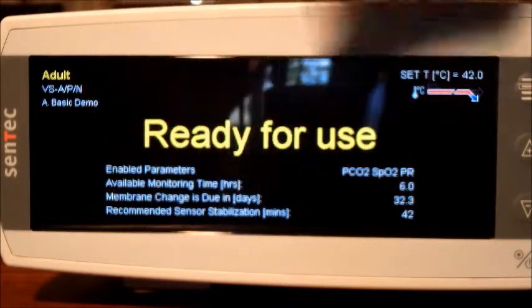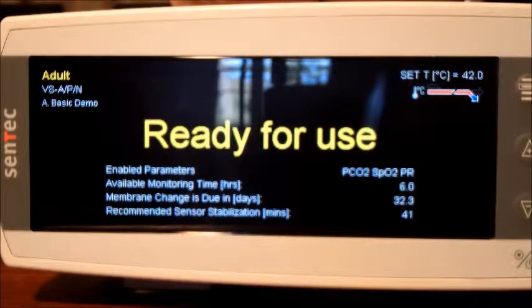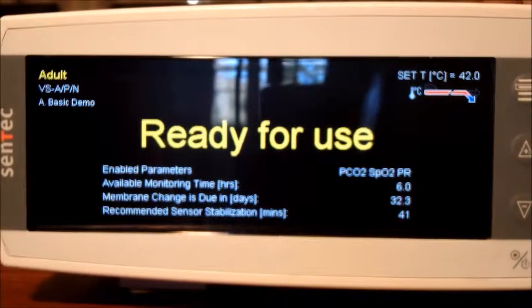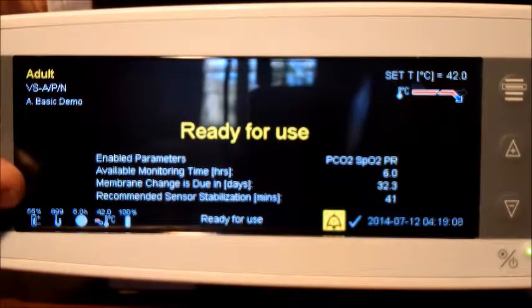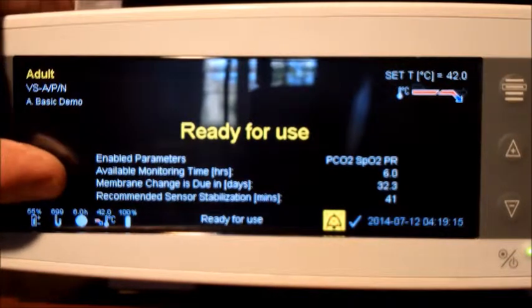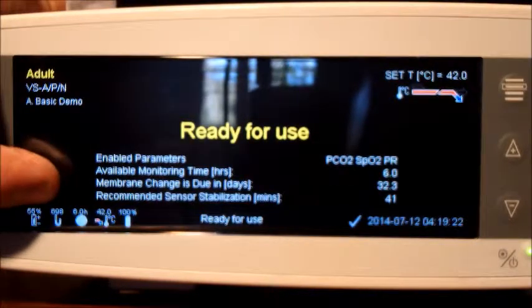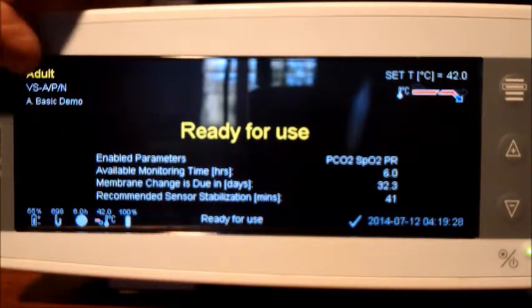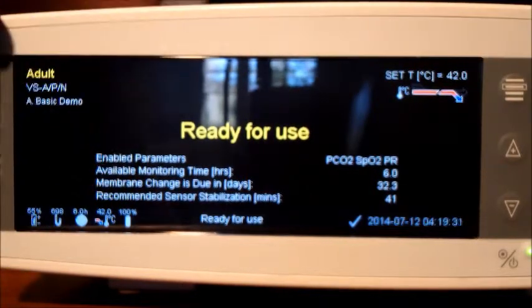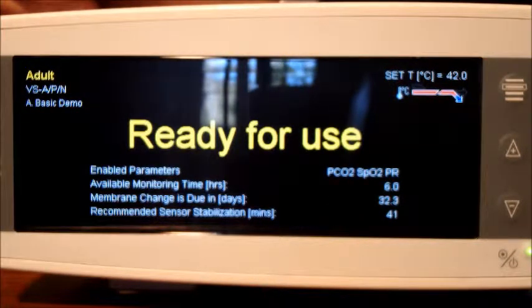We've got a recommended sensor stabilization time of 42 minutes. After that 42 minutes we'll have an increased available monitoring time. Pressing the silence alarm button brings up the status bar. We can see 55% battery life. The machine measures barometric pressure directly rather than making a guess, which is one of the fudge factors taken out of the calculation. We've got a probe temperature set to 42 degrees and a 100% calibration - so this machine is all 100% ready to go.